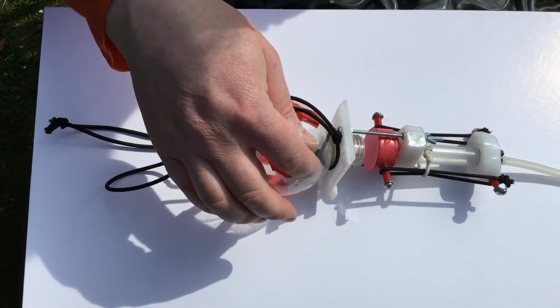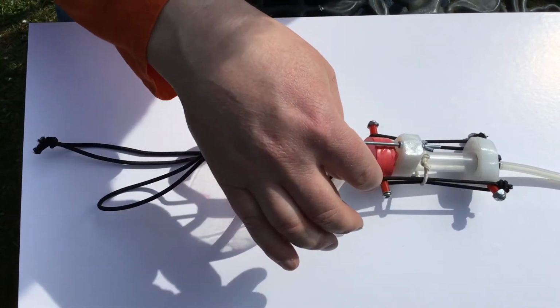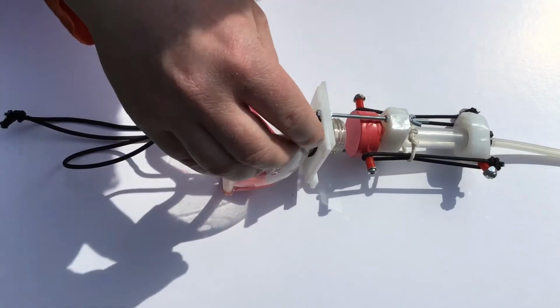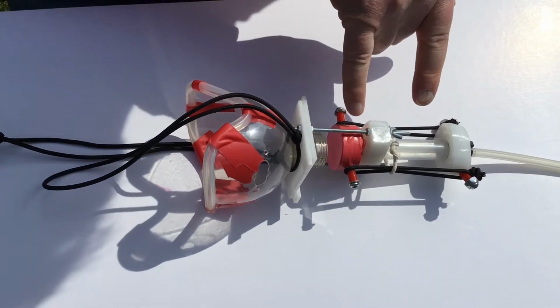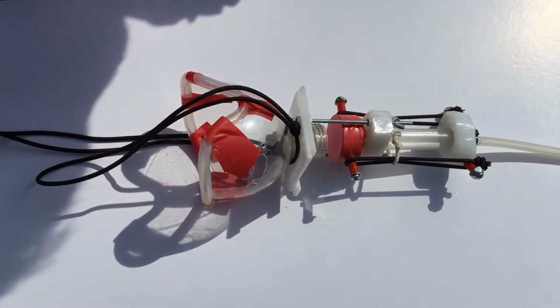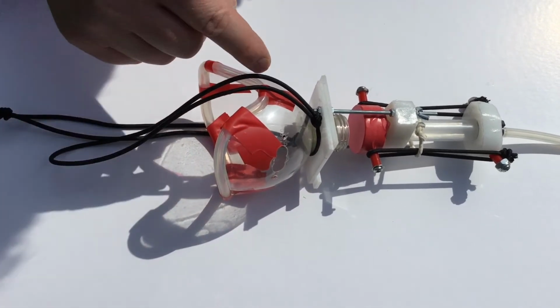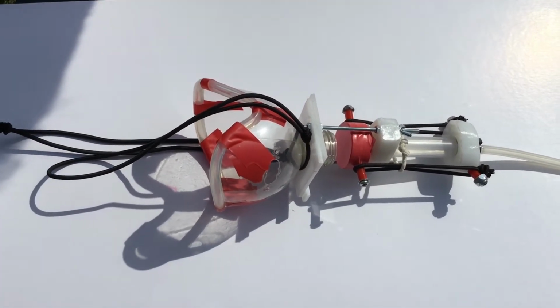This inlet port, for what would be an inlet port here, has never been used. What this was originally was the exhaust port, and the syringe was located here, but it didn't work very well in that location because the material is too flexible. And so I decided to move the valve for the exhaust port to the nose of the bottle, where there's lots of solid structure to seal against. This rubber tube here is silicone rubber tube, which has just been split so that it can be slipped over the rim of the bottle to make the face seating better and to make it more comfortable, although it could certainly be more comfortable still.